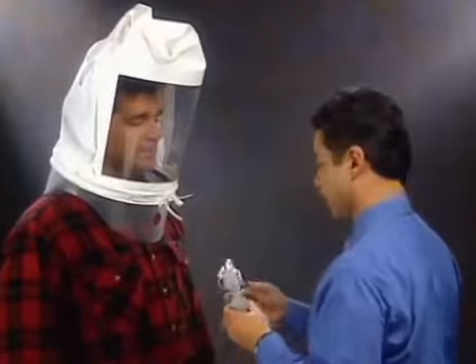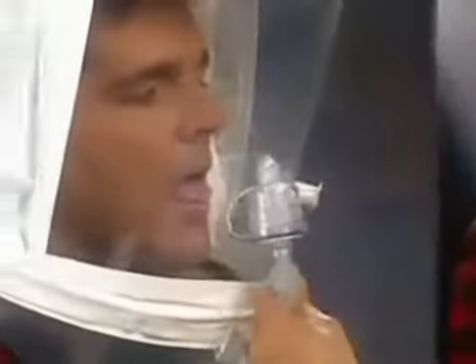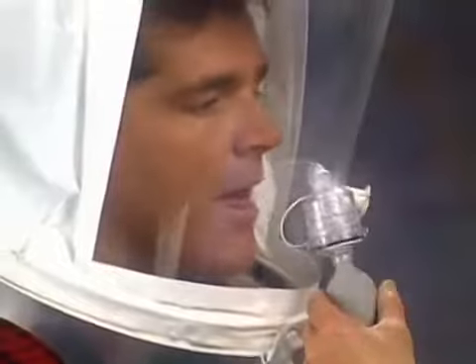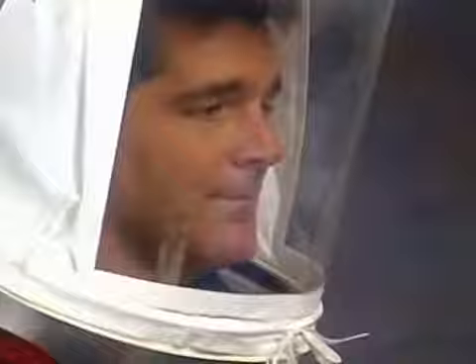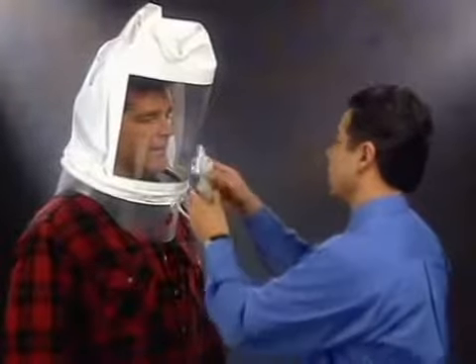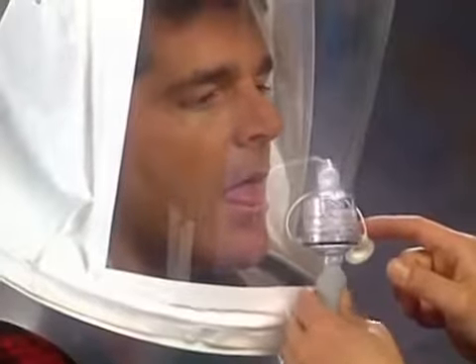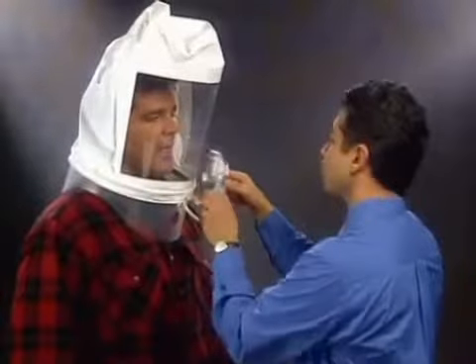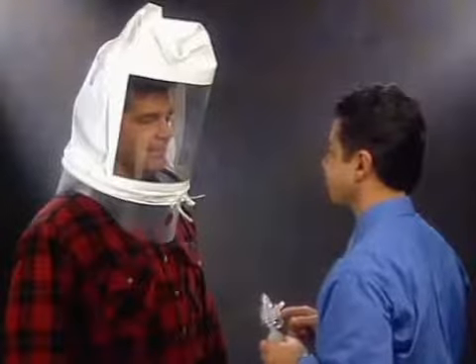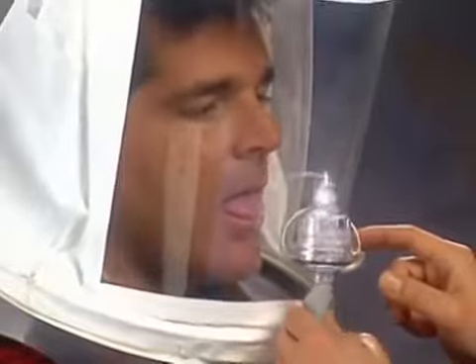If you taste the test agent, tell the instructor. The taste threshold will be noted as 10 regardless of the number of squeezes actually completed. If you can't taste the test agent after 10 squeezes, the instructor will put an additional 10 squeezes into the hood. If the taste is detected during the second 10 squeezes, the test is completed and recorded as 20. If you still can't taste the test agent, the instructor will add 10 more. If the taste is detected during the third set of 10 squeezes, the test is completed and recorded as 30.